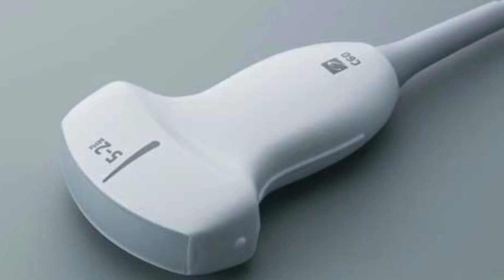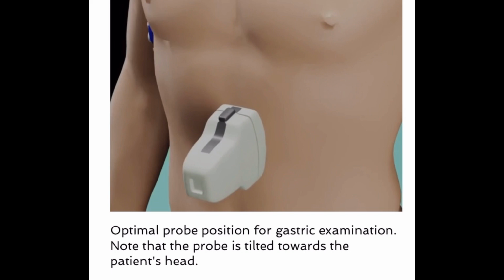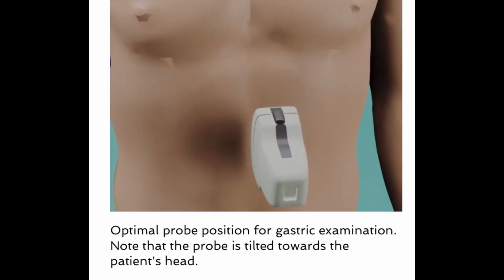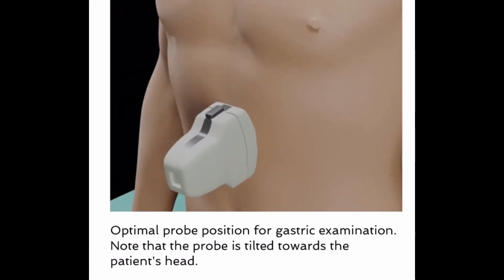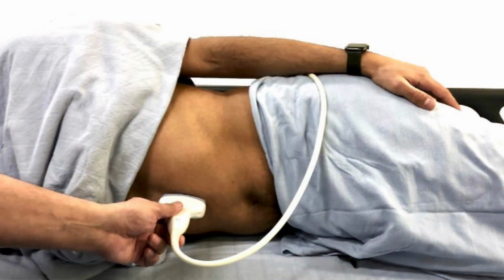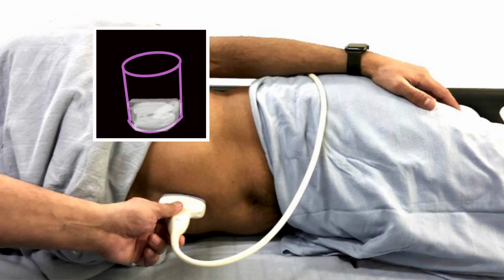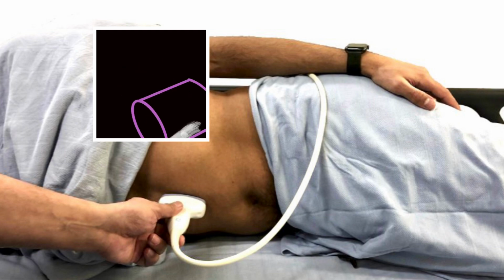Okay, what do we need to do this? A curved probe. So you're just going to place the probe in the sagittal position underneath the xiphoid. Scan the patient in both the supine and right lateral decubitus positions. Why are we scanning them in the right lateral decubitus position? Gravity. Yeah, the stomach contents are going to spill over once you move them to the right lateral decubitus, assuming there are contents that are hiding from you.